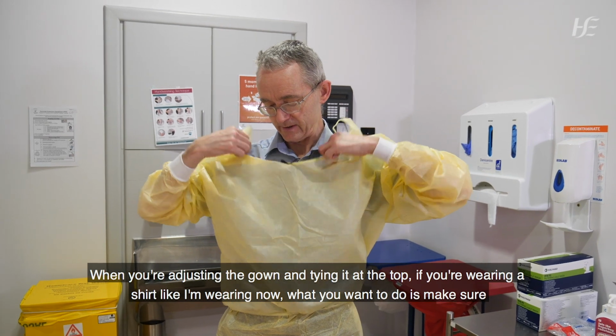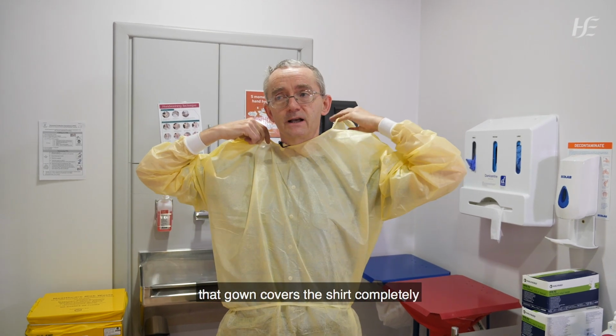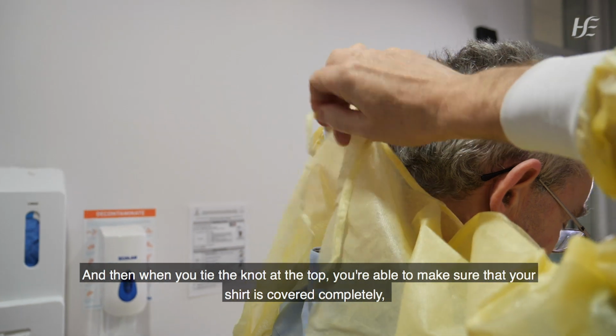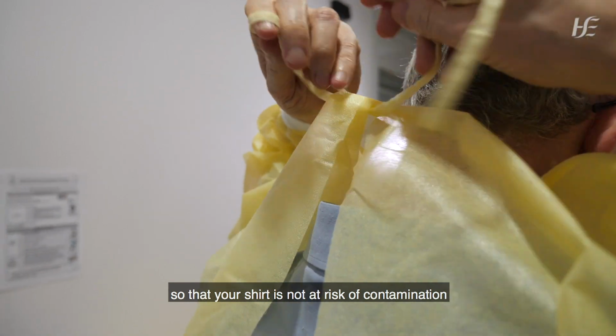When you're adjusting the gown and tying it at the top, if you're wearing a shirt like I'm wearing now, what you want to do is make sure that the gown covers the shirt completely, and then when you tie the knot at the top, you're able to make sure that your shirt is covered completely, so that your shirt is not at risk of contamination.